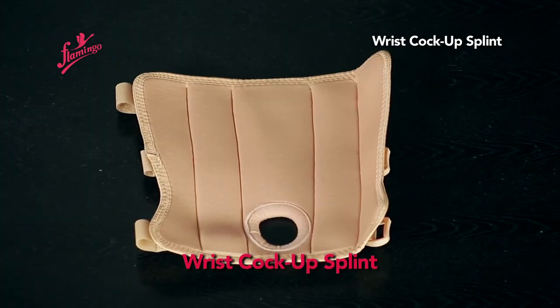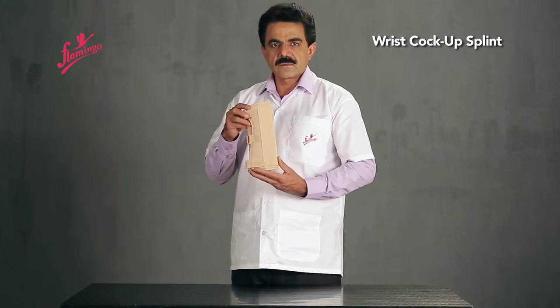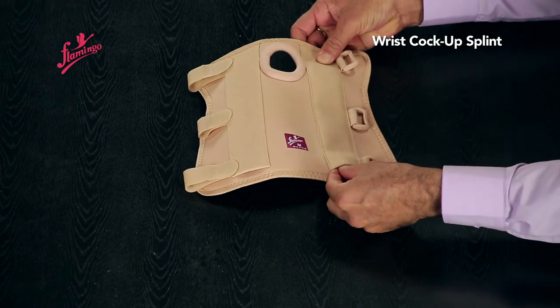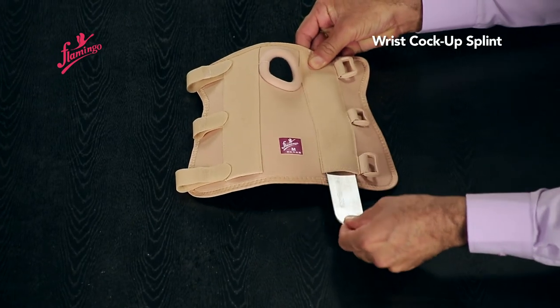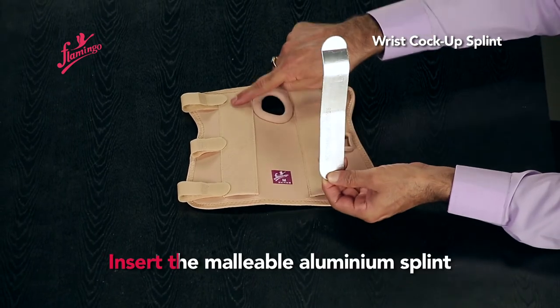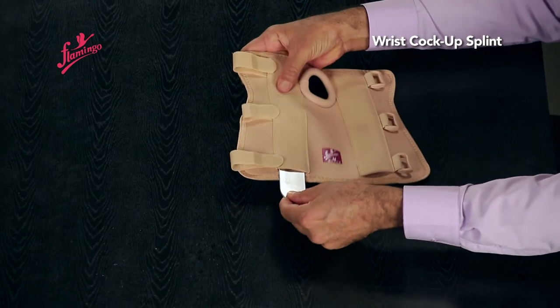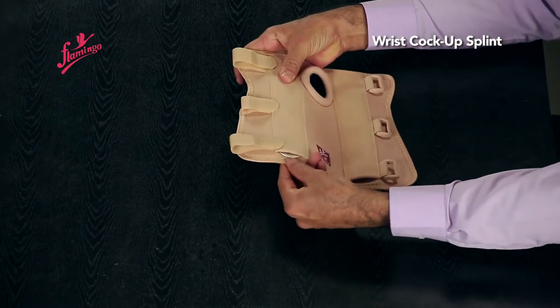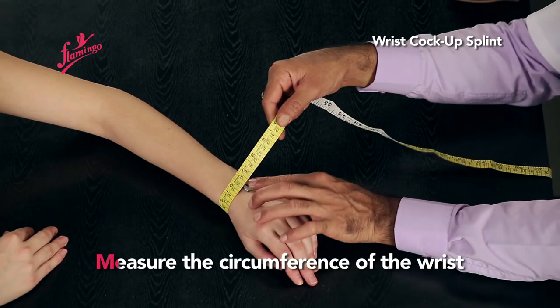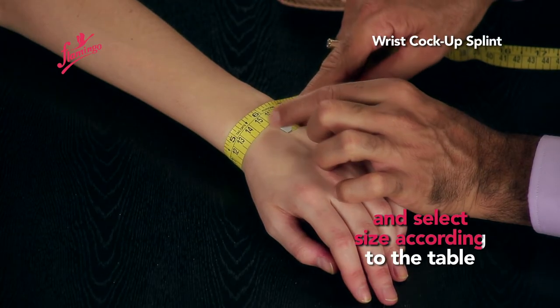Cock-up Splint. Insert the malleable aluminum splint according to the side to be worn. Measure the circumference of the wrist and select the size according to the table.